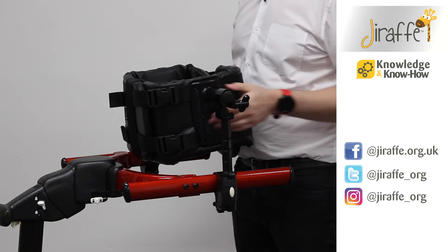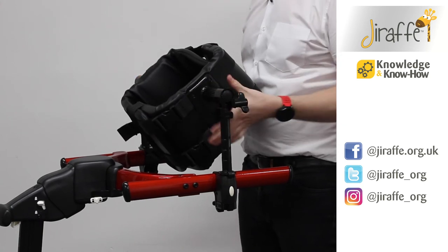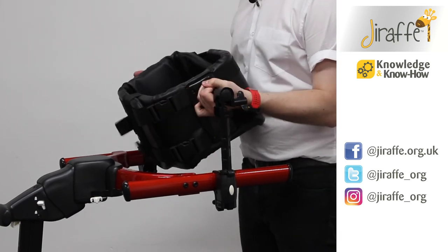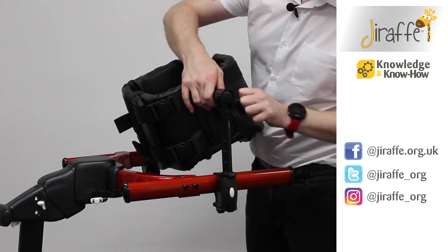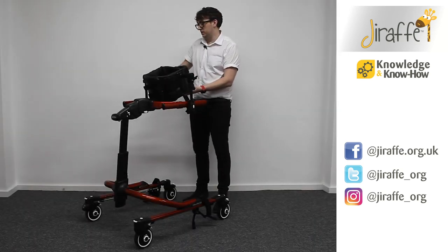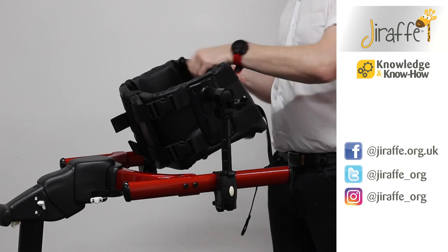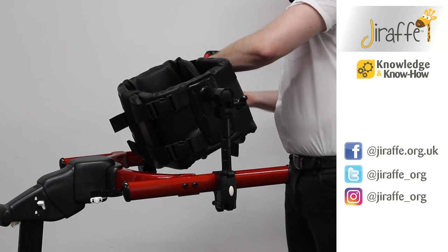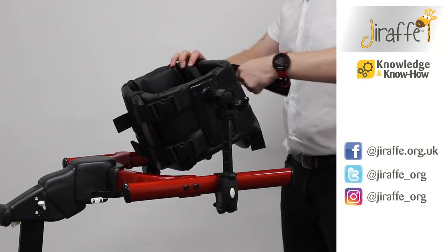Before we tighten those wing knobs, we're able to adjust the angle of the chest prompt to be more of an anterior tilt or we can offer more of a posterior tilt. Once we've found where we want to tilt the chest prompt, we can then tighten the wing knobs. If we are transferring the client into the chest prompt, we can then clip, transfer our client in, and then attach the clips. We can then tighten those straps at the back to give a secure fitting.